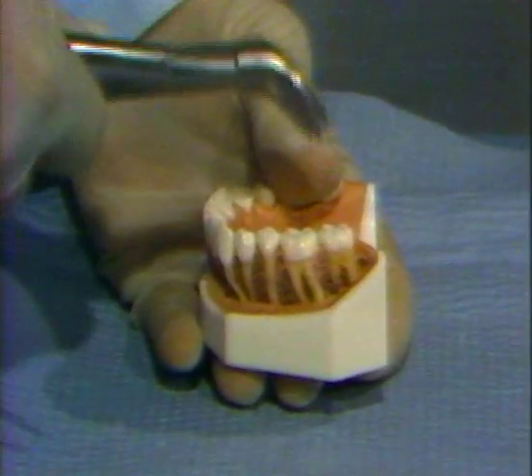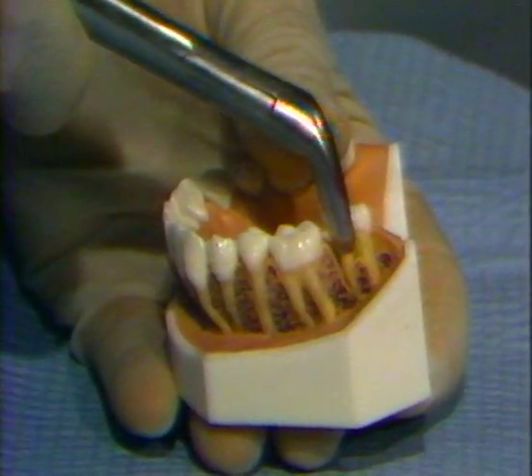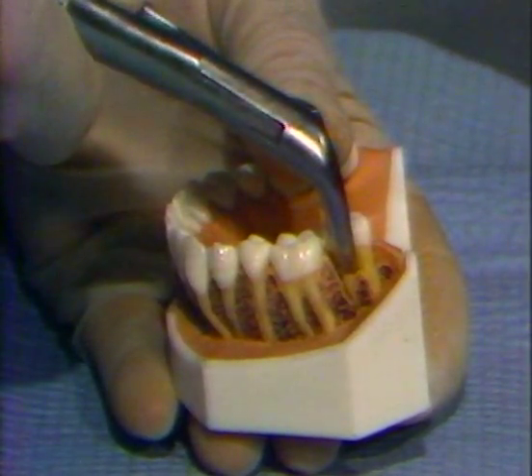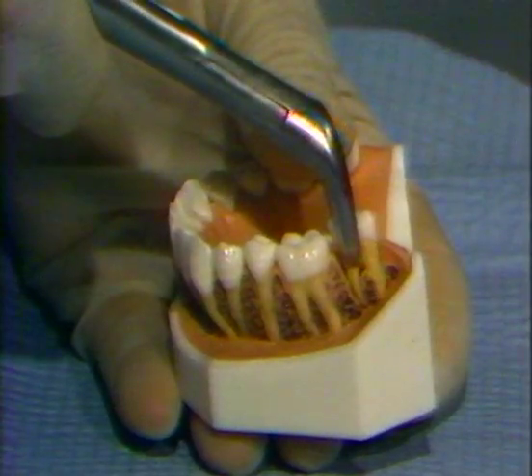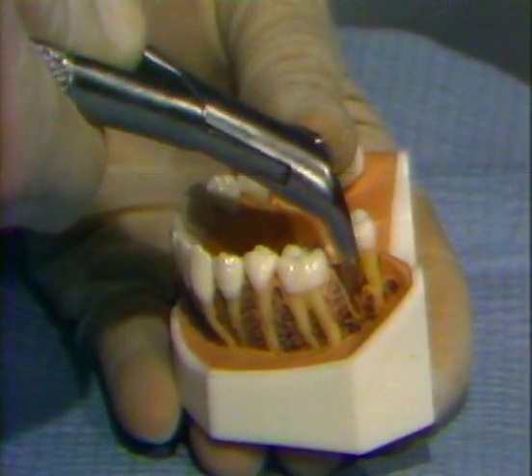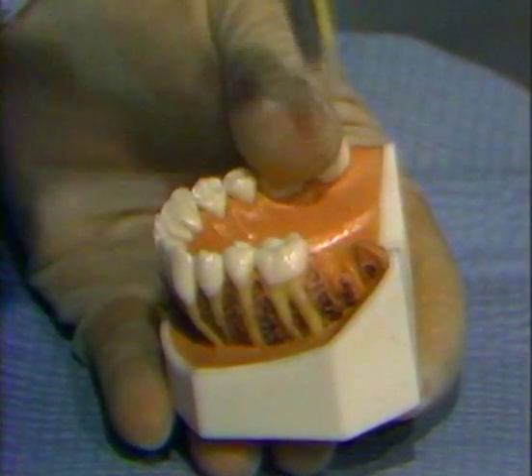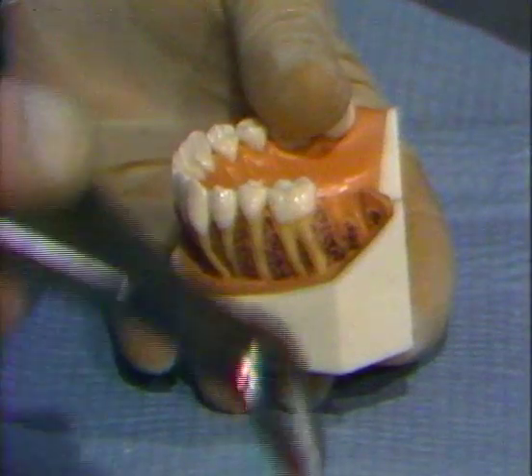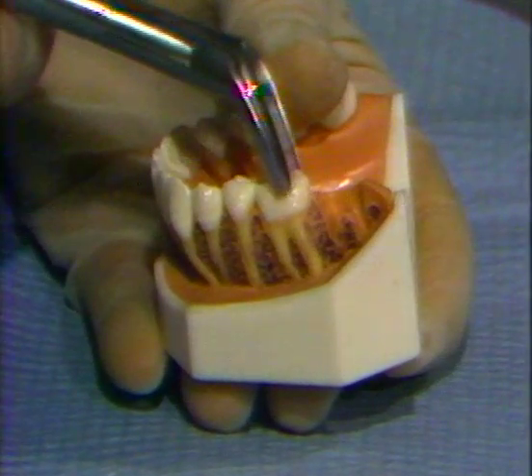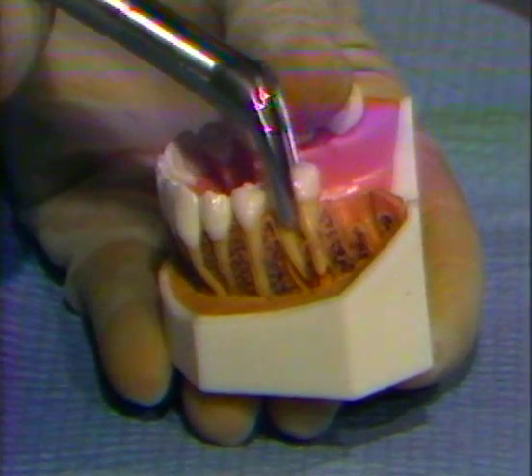The first movement is to the lingual side, followed by movement to the buccal. Repeat these movements several times and apply moderate mesio-distal rotation. This is followed by an upward motion in line with the long axis of the tooth. This should be done gently and slowly to prevent forceps hitting against the maxillary teeth when the tooth is finally released from its socket.